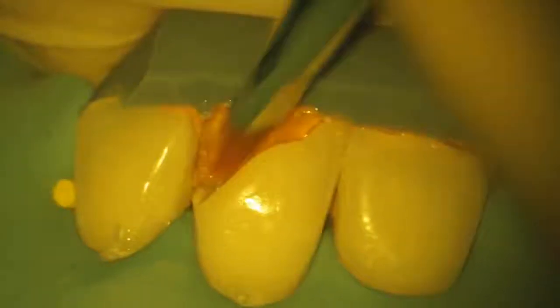Adaptation of the palatal wall and palatal index to its original place, and removing some irregularities of the surface, correction of shape and thickness of the palatal wall. The composite constantly sticks to the surface of the instrument, and the process of modeling becomes absolutely uncomfortable. The only way we can overcome the disadvantages of this material is to use a paintbrush with some amount of modeling resin.